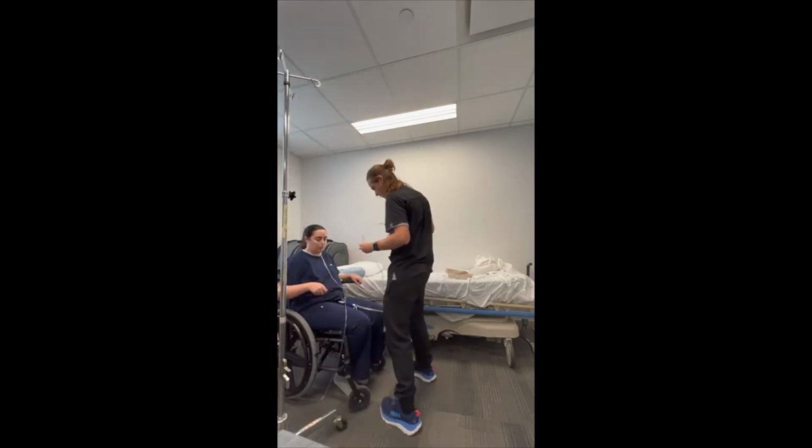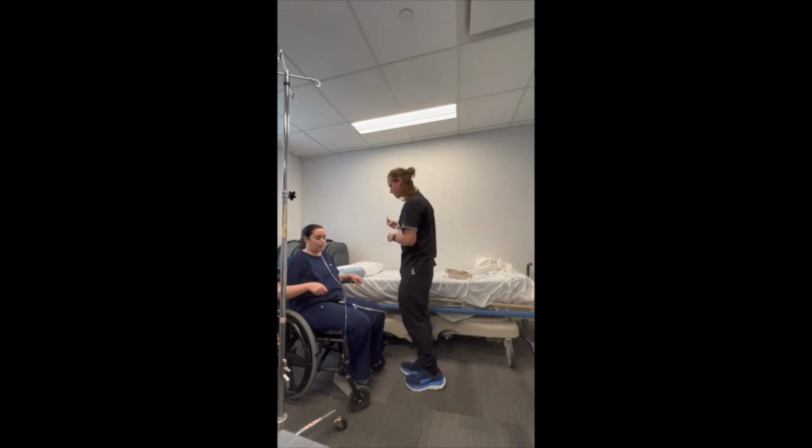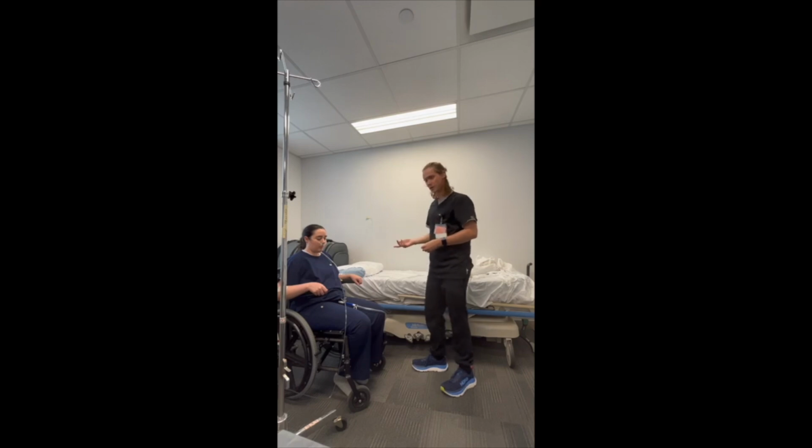And as you're plugging everything back in and hooking the patient up, it's easy to get everything tangled, so make sure that we visualize the origin and destination of everything. Then we're going to run through real quick, before we head out, a check-in with the patient: do they have the call bell in reach? Is the chair alarm on? Is everything hooked up the way it was at the start of the session, or the way it needs to be? If you've unplugged anything like monitors, telemetry, blood pressure, and oxygen are the ones you see most often, make sure those are all hooked up again.